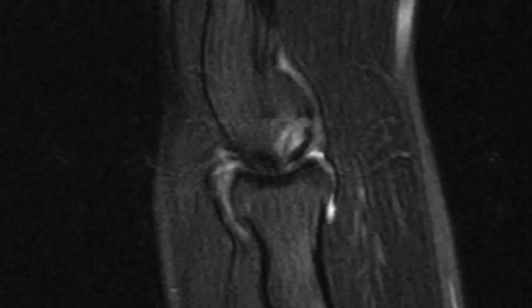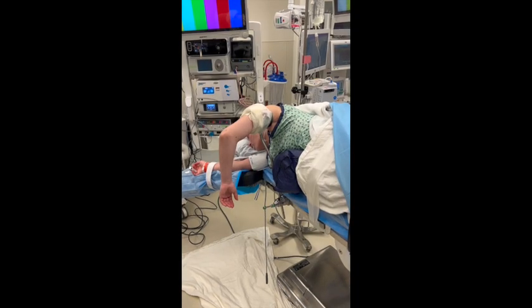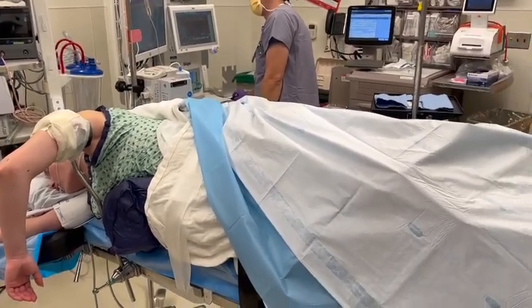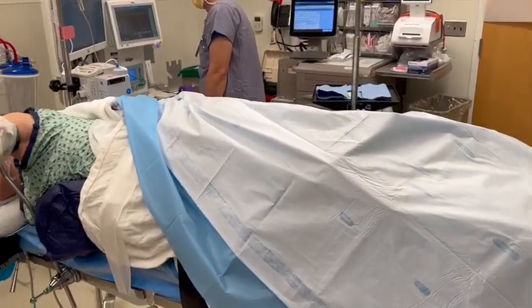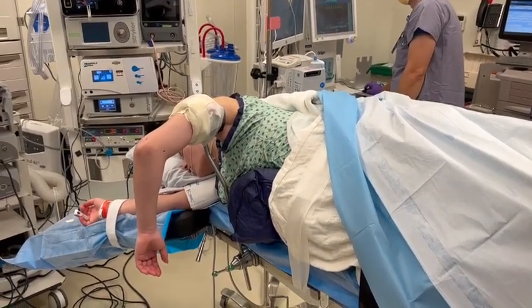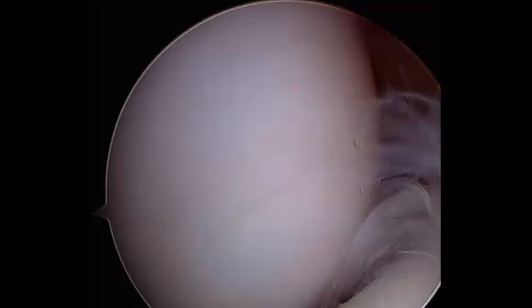to the large size of this lesion, which we measured approximately 14 by 10, the decision was made to proceed forward with an osteochondral allograft using the megaotes set. The patient was positioned lateral for a diagnostic elbow arthroscopy. Prior to open intervention, diagnostic arthroscopy was performed.